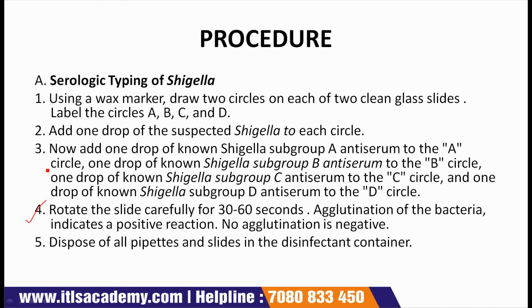Next point, rotate the slide carefully for 30 to 60 seconds. Agglutination of the bacteria indicates a positive reaction. No agglutination is negative. Dispose of all pipettes and slides in the disinfectant container.